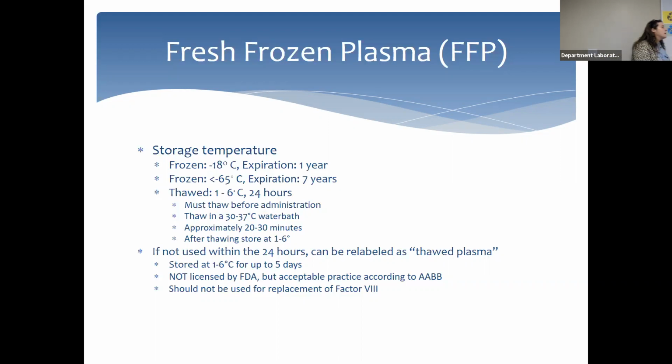I say that because it will make more sense why somebody would want to put it in a microwave. If you have a very strong cold reacting antibody and a patient needs transfusing, we will recommend the use of a blood warmer prior to and during the transfusion. Some nurses might interpret that the wrong way, meaning that they need to warm the blood up by putting it in a microwave. That story never happened to me personally, but it came from somewhere. I always share that. It's funny, but it actually did happen, which is scary.